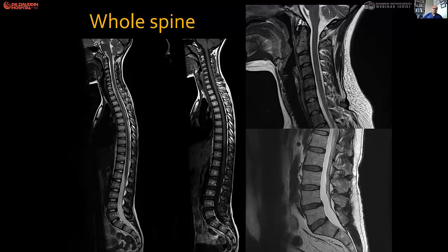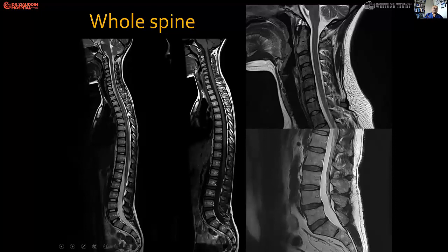There is a value of having both T1 and T2. T1 images see tumor or bony infiltration and fat replacement of the marrow better, while T2 images will see cord compression better.